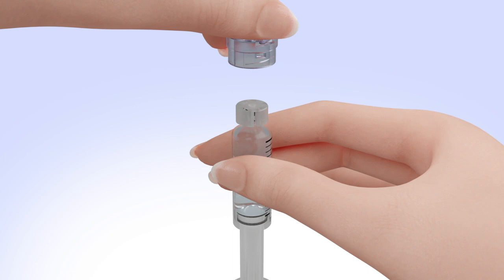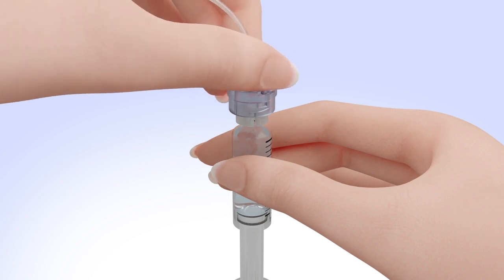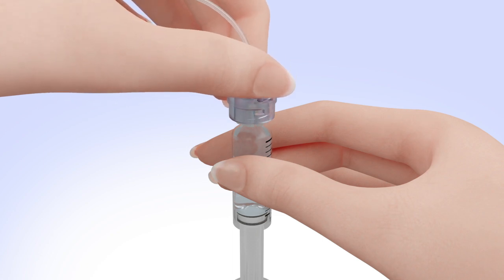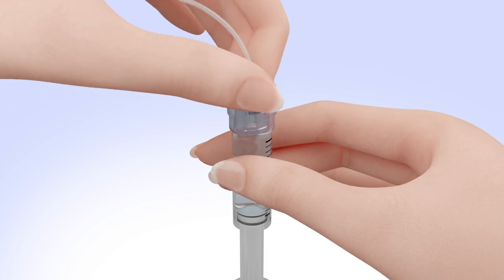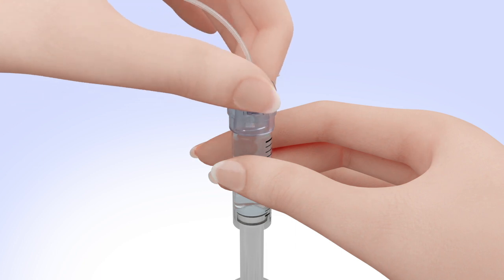Hold the tubing by the connector and place it on the top of the reservoir. Find the right position by turning and gently pushing the tubing connector until you feel it slide smoothly in place. Turn the tubing connector clockwise until the reservoir and tubing connector lock with a click. The tubing connector should not be loose or come apart from the reservoir.